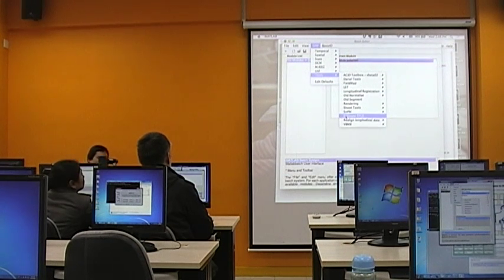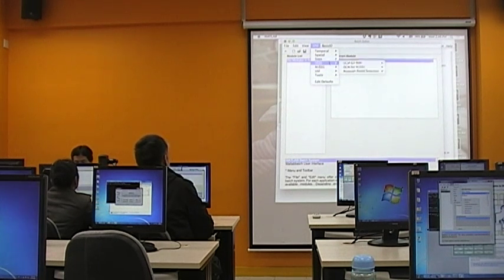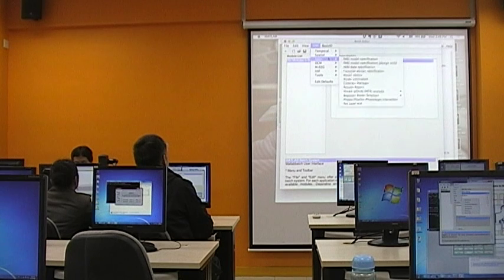But you could always add some new toolboxes, because if you go to the SPM web page, you will find out that there are so many extension tools that work together with SPM, some of them are standalone packages that help you to do something. So if you're interested, you could always play around with these toolboxes and try to see if they will aid your analysis. But anyway, the main functionality you are going to use would be mainly on the statistics.